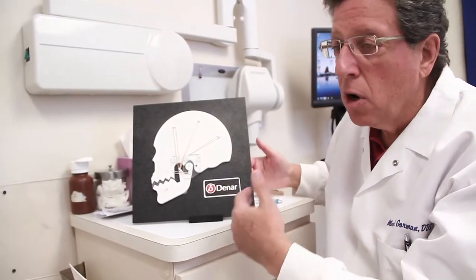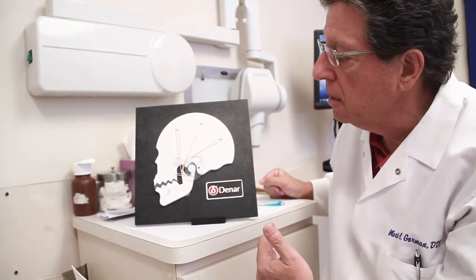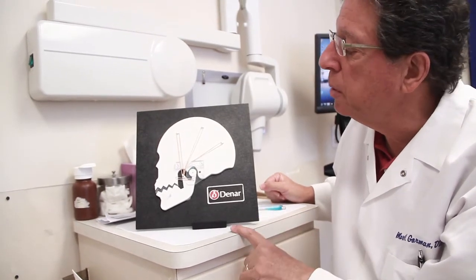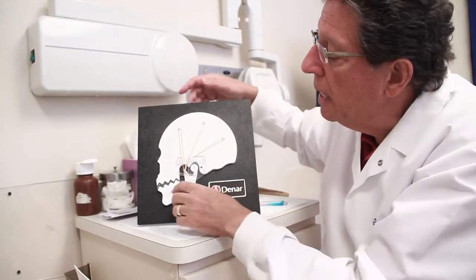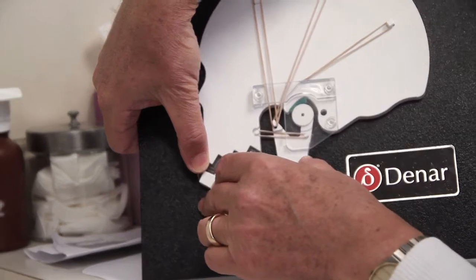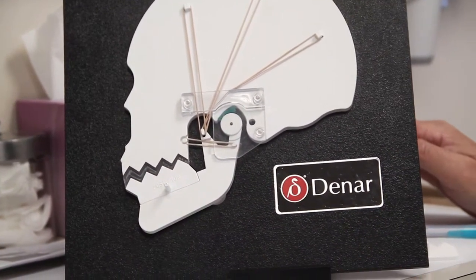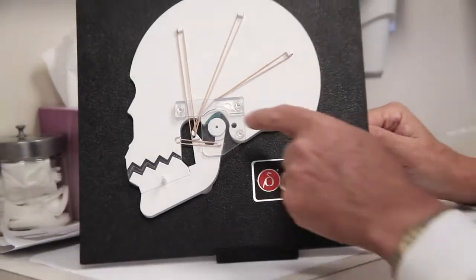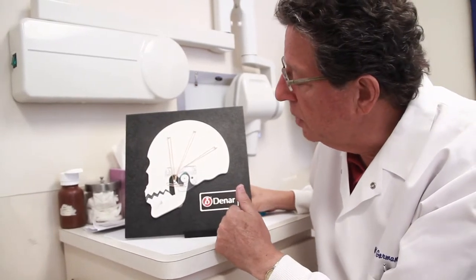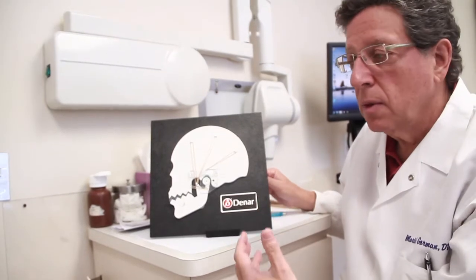The fluids and the cartilage can reposition, the fluids can be taken out of your body, inflammation starts going down, and it's a process. In most instances it's 15, 20, 25 visits with the appliance, adjusting the upper appliance. They can come in on the first visit and you adjust the appliance so everything arcs in and feels really nice, all the marks are in the right places with the articulating paper. But what happens as this starts healing and the fluids start getting removed from the TMJ region and inflammation starts shrinking?